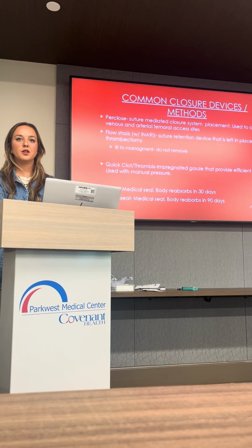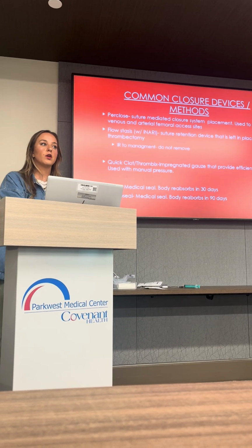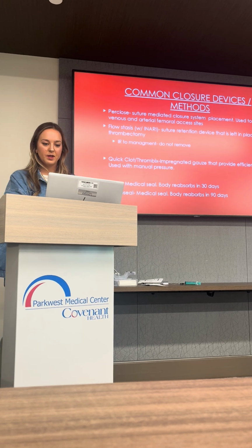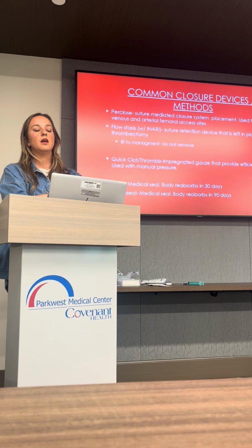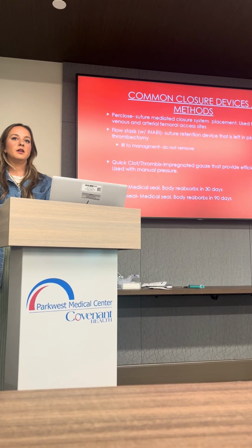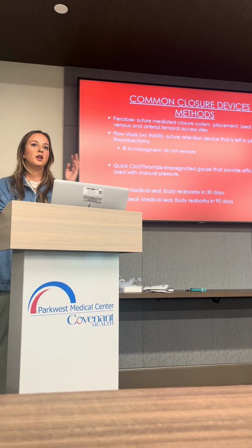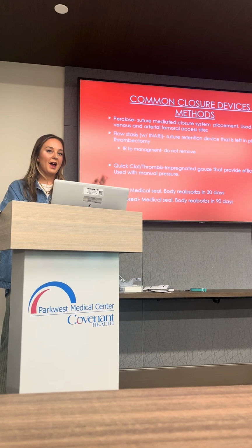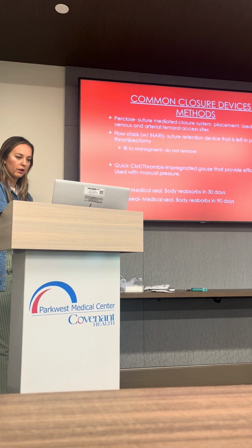The provider that comes to manage the pump or to pull the pump is the one that's going to be using those, but you need to be aware if they're in the room. If they're not in the room, then you need to make sure that they're in the room for the patient if that's something that's in place. It should be noted in procedural notes if patients have these in place. So that's why it's so important that you're reading documentation. That's something that's not often transferred over to other notes. So if anything else, make sure you're reading your documentation on your patients, know what patients have had procedures, what those procedures look like, and if these devices could be in place. That way you can prepare accordingly.